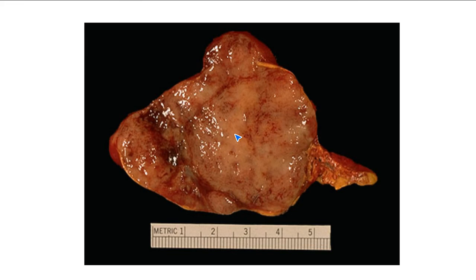So a neoplasm arising in the medulla is going to be what until proven otherwise in an adult patient. Let's say this is a person who is 32 years old. What would this most likely be? You've been telling me about it all session. Okay, pheochromocytoma, fabulous. So here is a pheochromocytoma.